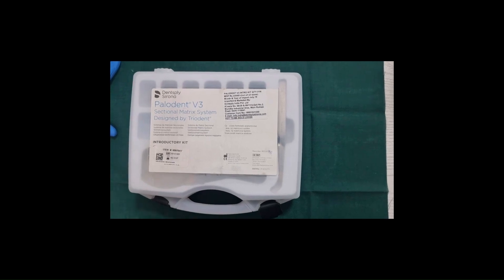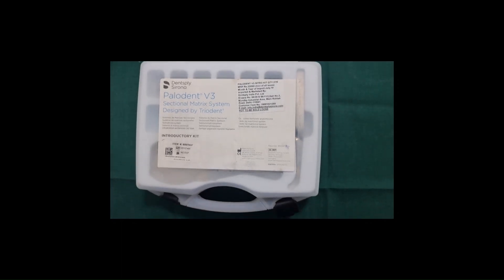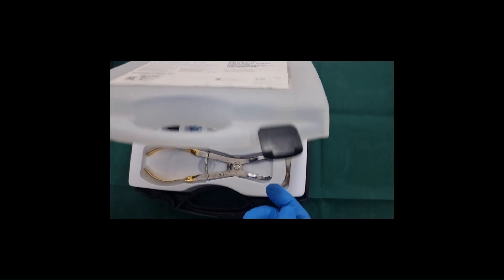Hi viewers. I am going to demonstrate placement of Palodent V3 sectional matrix system for a class 2 composite restoration.